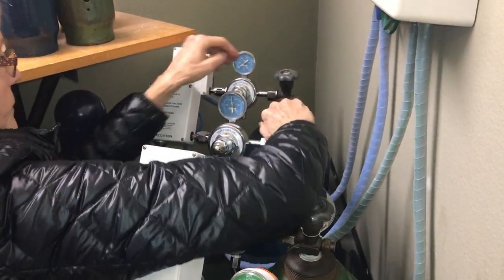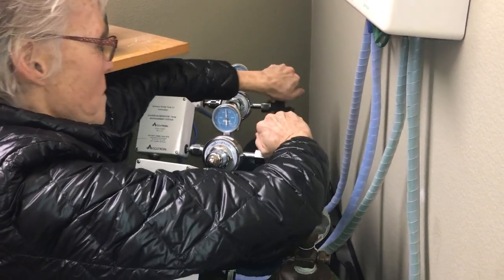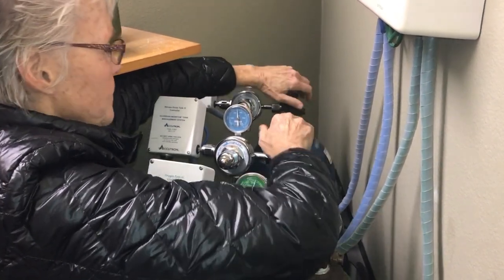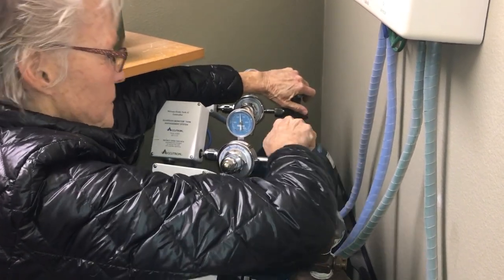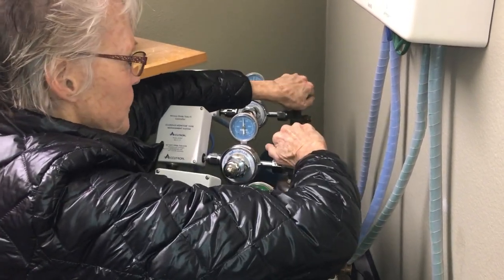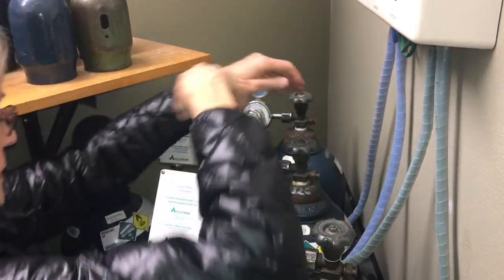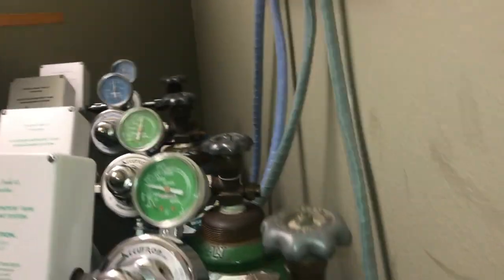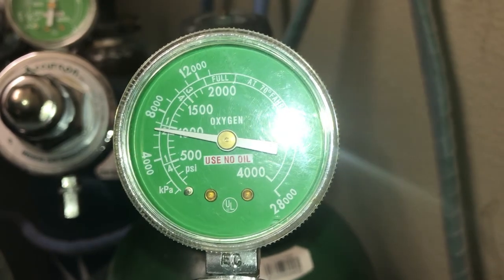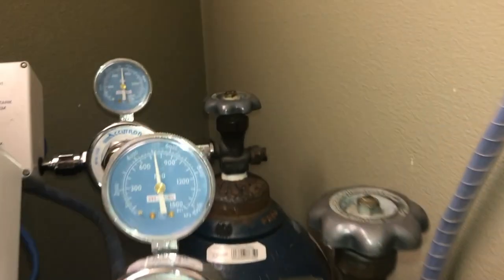You will remember from pain control that nitrous oxide gauges may not demonstrate the exact fill level of the tank. However, the oxygen gauge might be more accurate based on the type of gas. If we look more closely at one of the gauges for the oxygen, you will see it says 'use no oil.' Make sure you are using no lubricants or oils near these gauges or openings due to flammability.